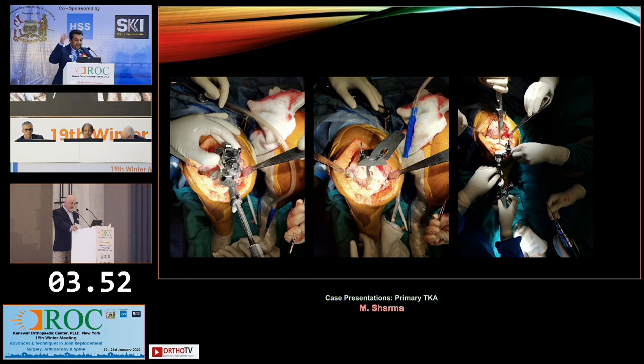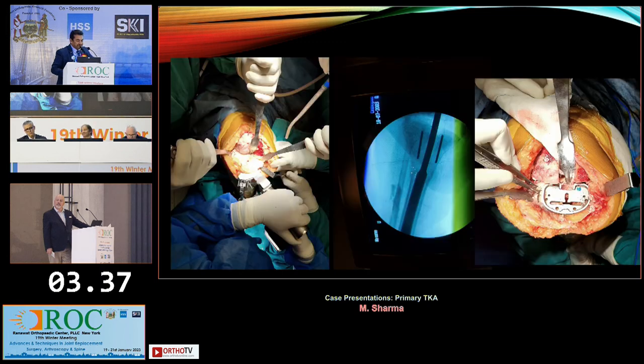I had to put in an intramedullary rod and use an extramedullary jig to do the cut. The other option would have been to plate the fracture with a short unicortical plate, reduce it, align it, and then do an approximately well-aligned cut. I checked the reaming with the C-arm, and as Dr. Rajpal mentioned, the tibial plate might not be sitting in the center — so an offset stem was needed.